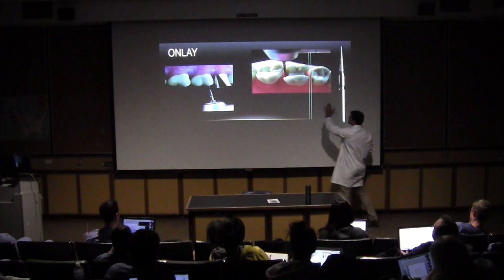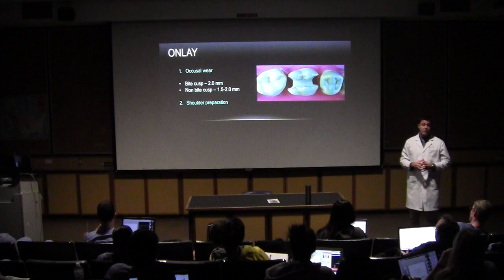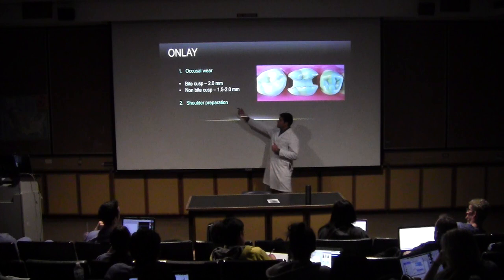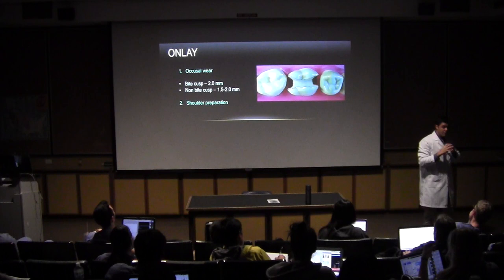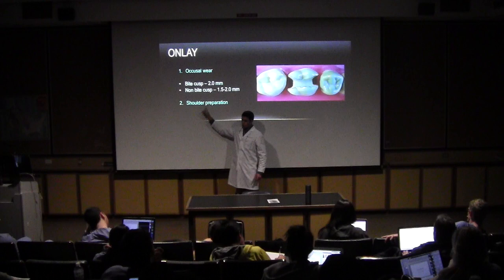So here, if we are going to work on the bite cusp, we must have at least 2 millimeters of reduction of the cusp. If we are going to work on a non-bite cusp, this reduction could vary from 1.5 to 2 millimeters. If you have enough room with 1.5, that's okay, on a non-bite cusp, all right? And then we are going to do the shoulder preparation, okay?